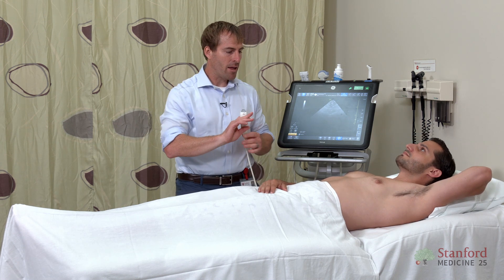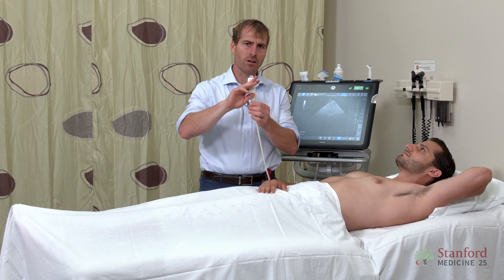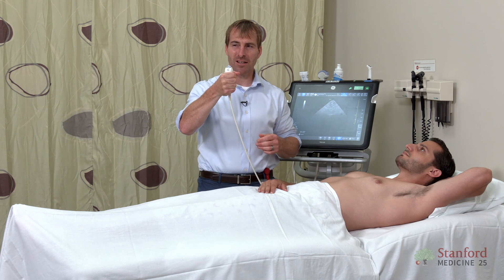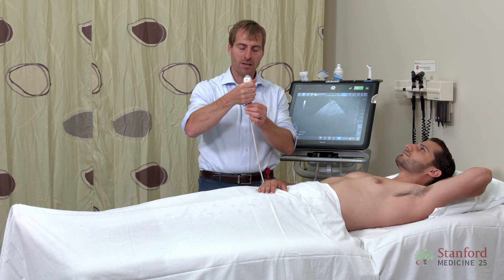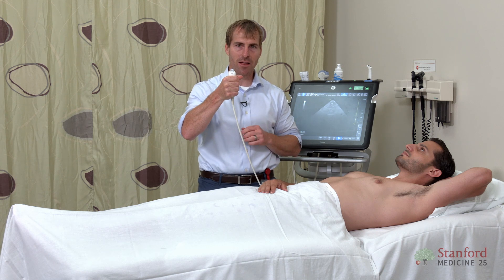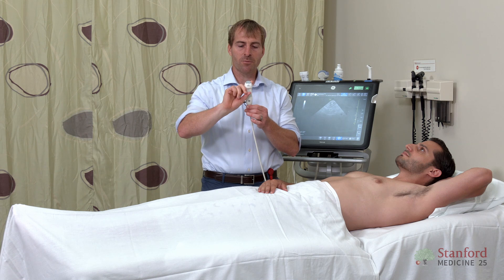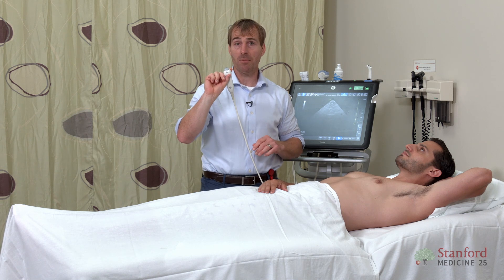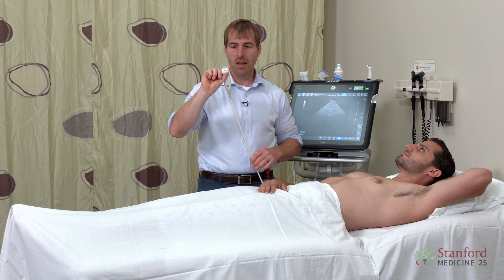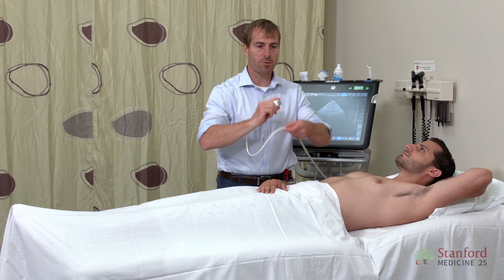I'm going to grab the probe and show you how to hold it. Many early ultrasonographers want to hold it like a microphone. The companies design these probes to look very ergonomic, so it feels natural to hold it that way — but this is not the correct way. You're going to have a lot of trouble manipulating the probe appropriately. What I encourage you to do is hold it like you would hold a pencil, and that way you can move the probe much easier.